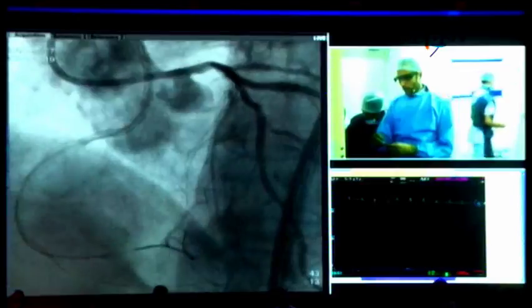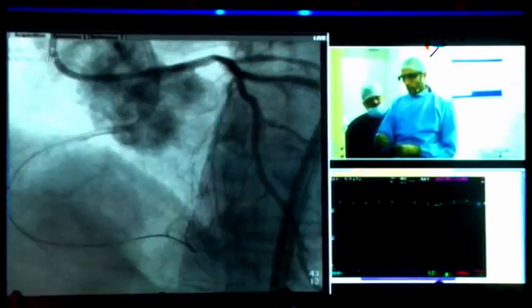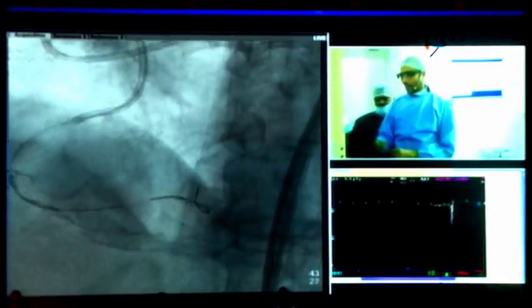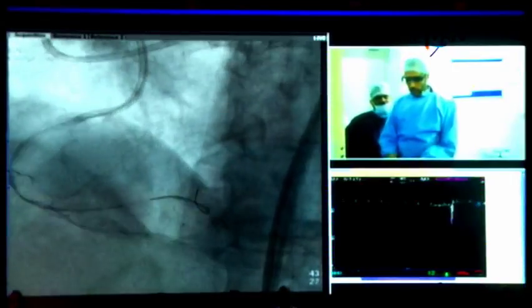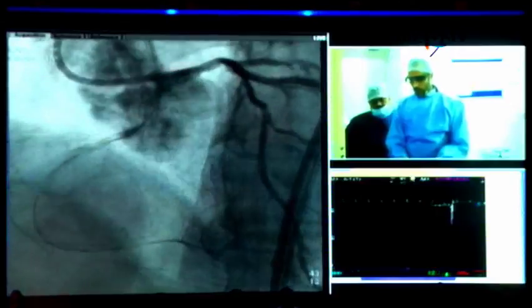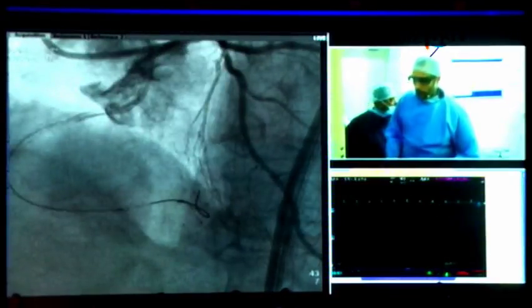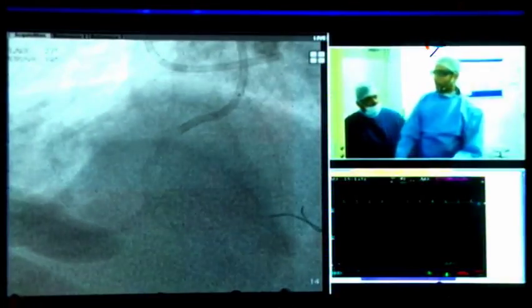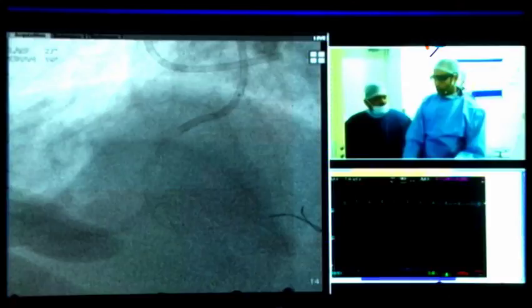What I'm going to do is if it's not true lumen, I'll probably do Stingray ADR, blind stick and swap double. If it doesn't work, I'll go retro, because I'm already there. It takes me another 5 minutes to try Stingray. If it doesn't work, then I'll go retrograde. So the first choice will be Stingray if it is not in the true lumen. Second is retrograde. Yep. Parallel wire is not an option for you? Well, if I had Crusade, it would be a great option, but I don't. I guess you could do it without it, but I prefer to do it with it. Okay, okay.